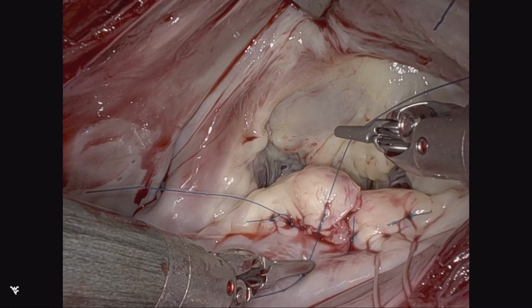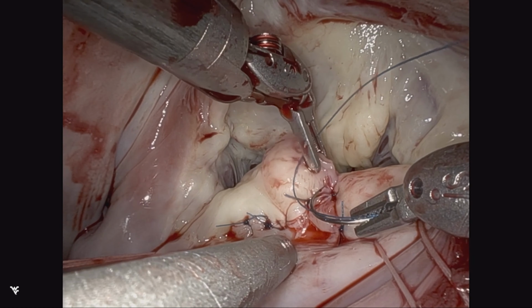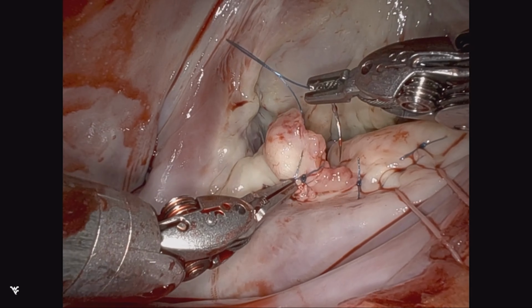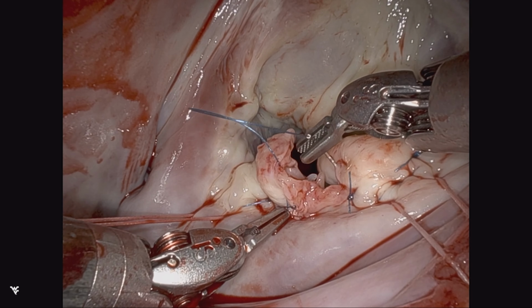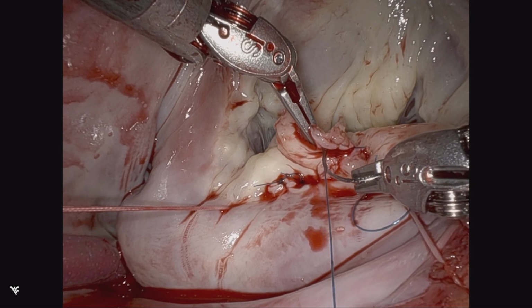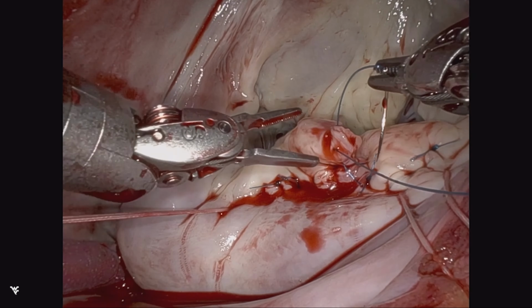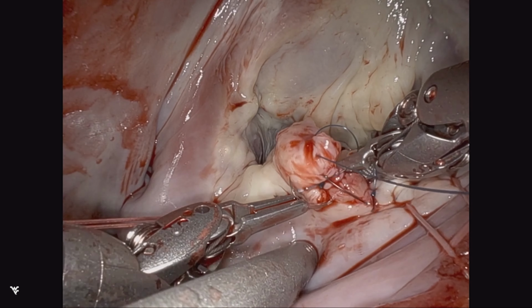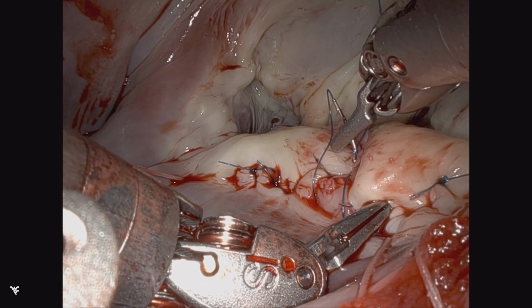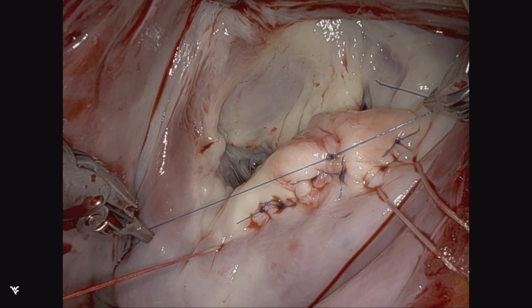But when there is tension on any of the leaflet areas, be it the anastomotic area, be it at the hinge point or annulus, that's when long-term failures might occur. So part of the mandate we must always follow is tension freedom. Because then we exchange the pathology of excess motion for restricted motion, which can have consequences down the road. As long as the leaflet mobility is preserved, one can expect normal physiologic function and durability.